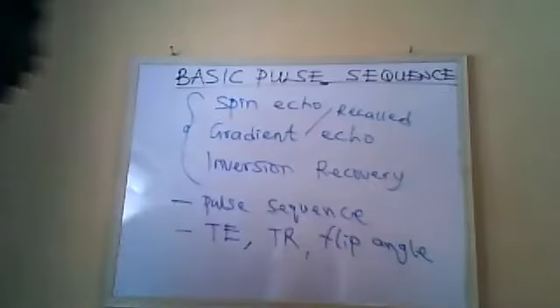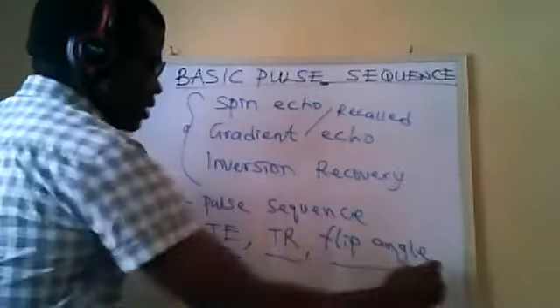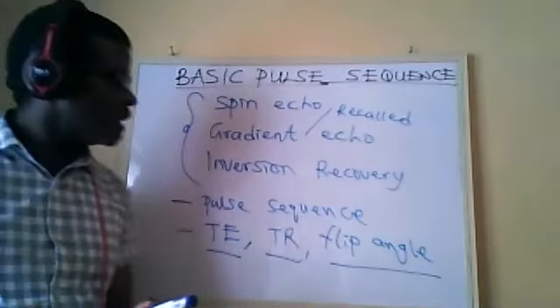So by way of introduction, we are going to look at these key terms: time of echo, repetition time, and the flip angle.